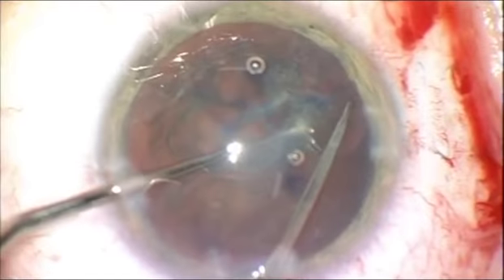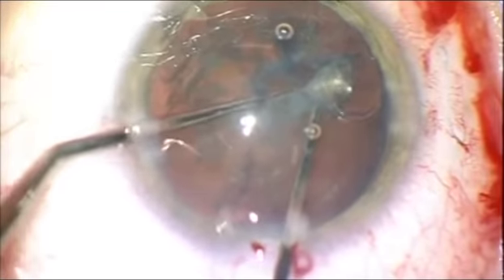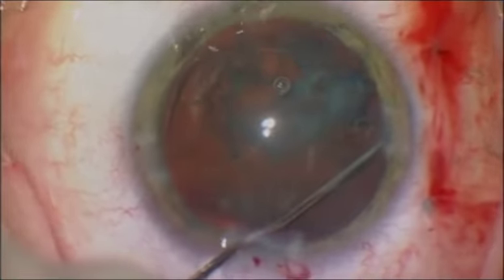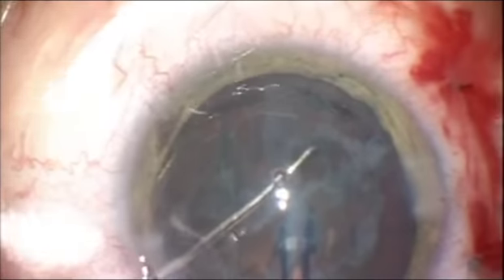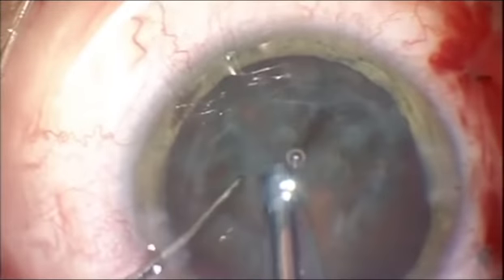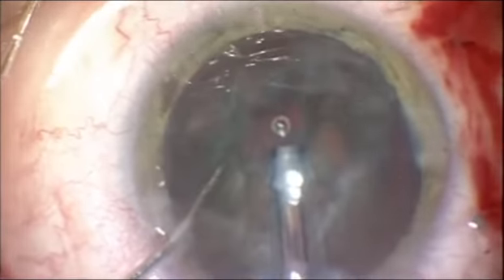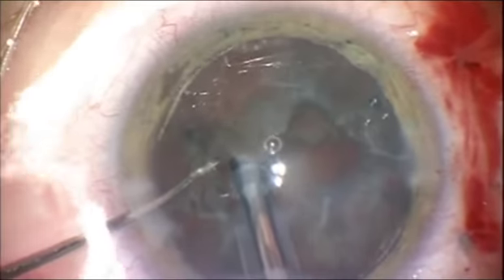Fixation element is placed on top of the anterior capsule in order to prevent changing the shape of the capsulorhexis. Hydrodissection is done very gently, followed by in situ phacoemulsification, utilizing combination of horizontal and vertical chops with settings adequate to get a good purchase of the nucleus material.